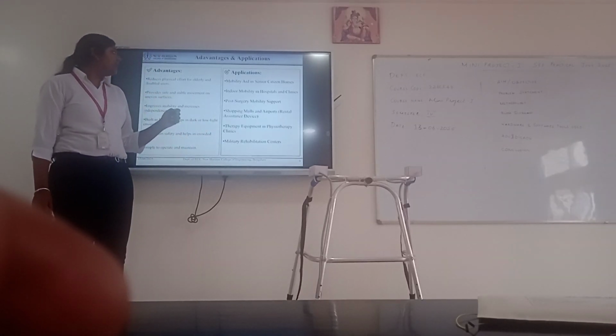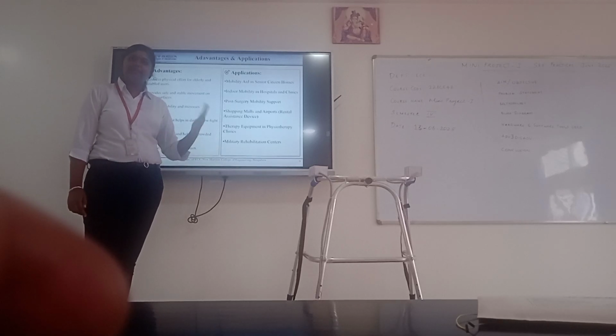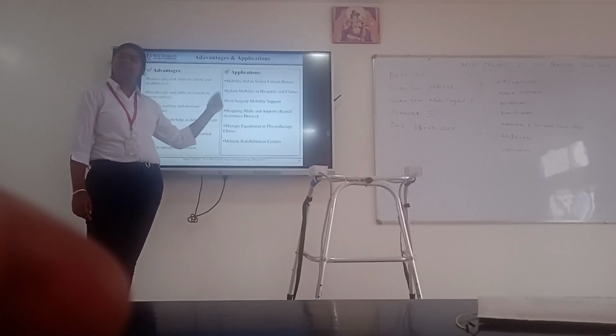Then applications: mobility aid in senior citizen homes. We can use this at home, for example, elderly people can use this for going to the washroom and coming back instead of another manual support. The same in hospitals and clinics.